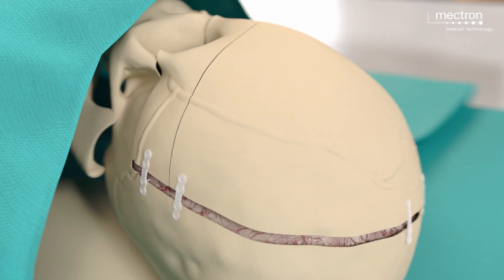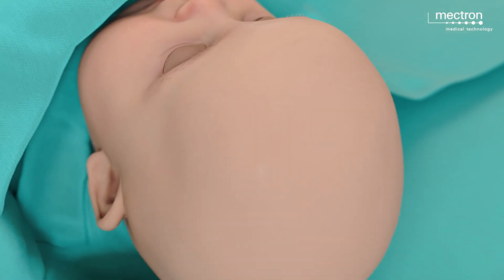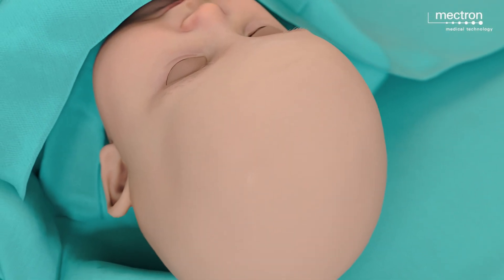The periosteal plane is sutured to cover the osteosynthesis areas, followed by suturing of the subcutaneous tissue and skin to complete the procedure.